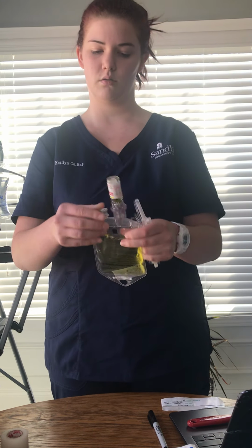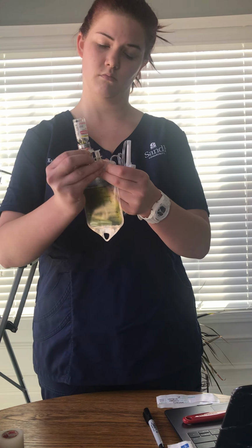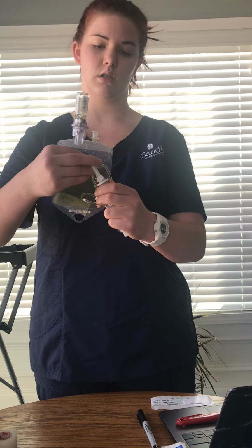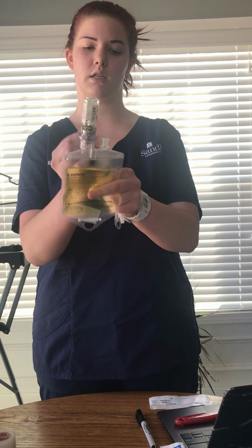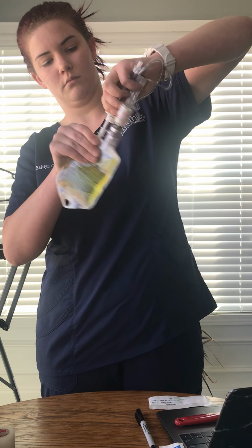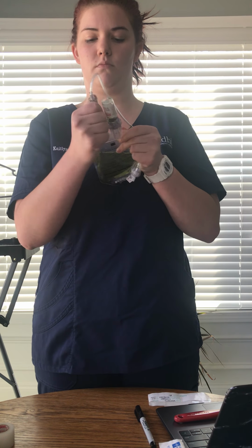And I'm going to peel this off without touching anything. I'm going to take this cap off and put this in here. And I already checked the lower clamp too.